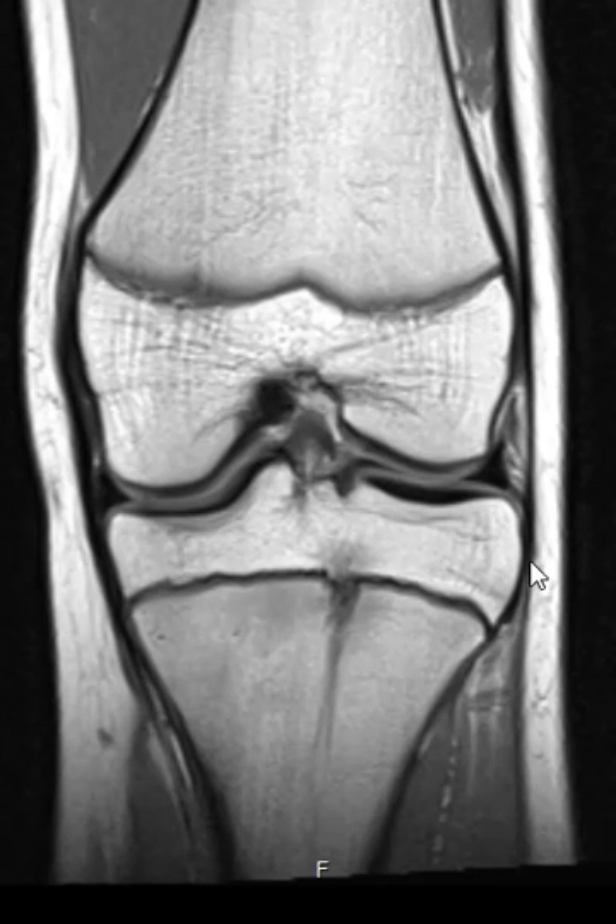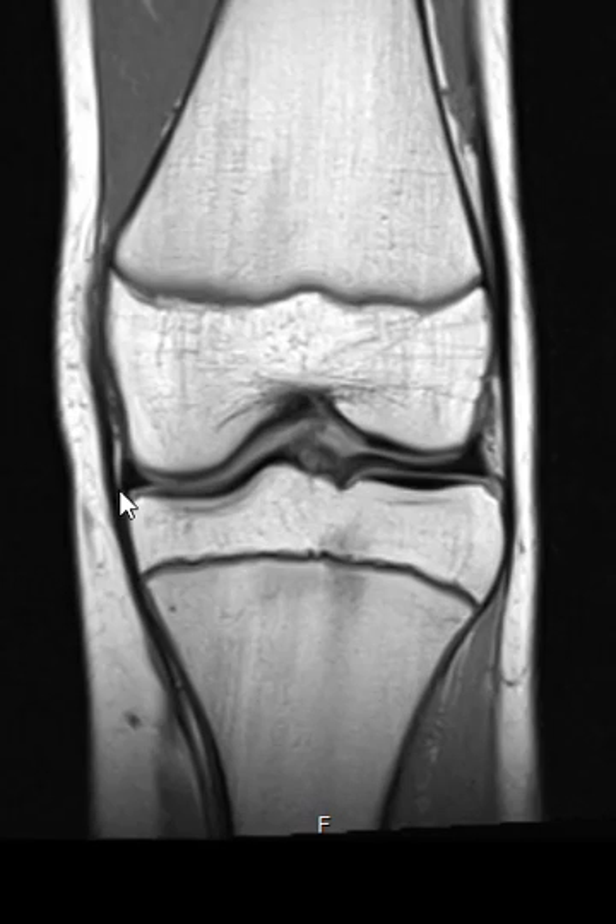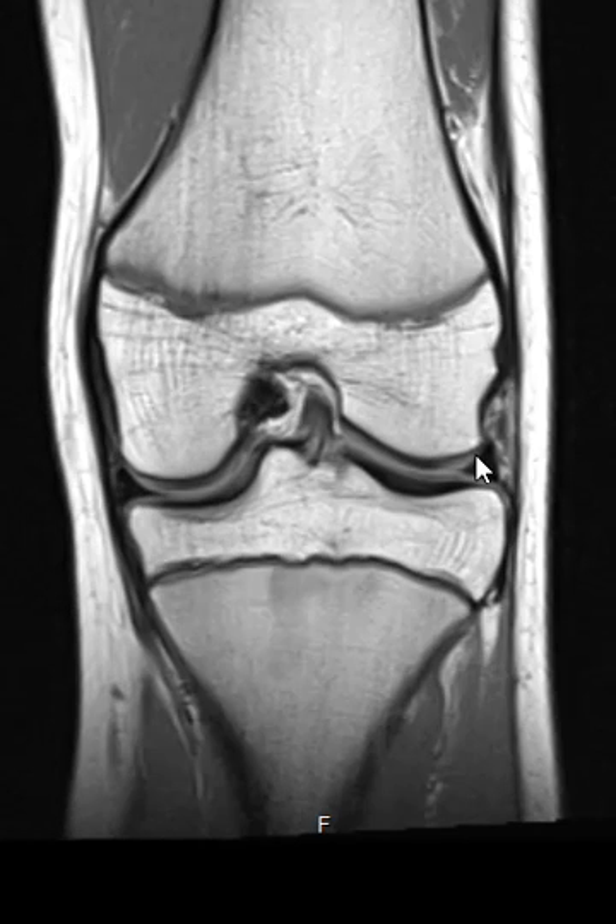This is a view where we're looking straight at the knee. We see the femur up top, and this is the knee joint. Down below the knee joint is the tibia. And we can see a meniscus — this little triangle here — here's another meniscus.